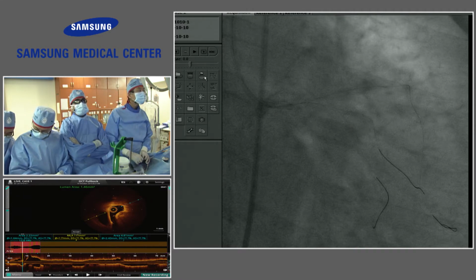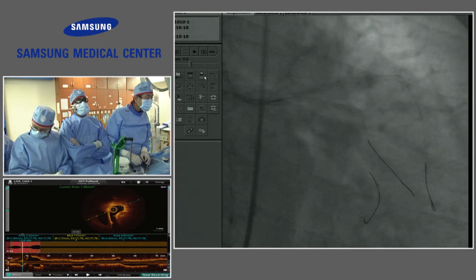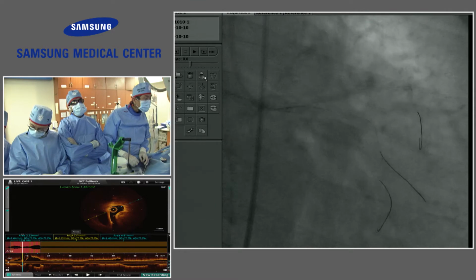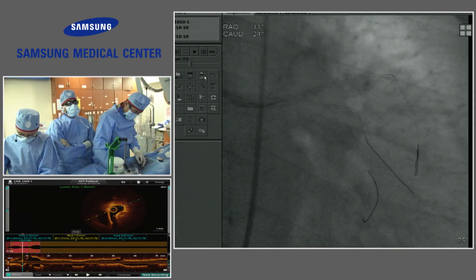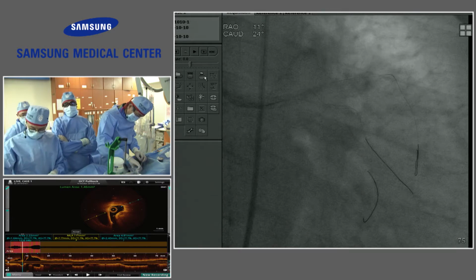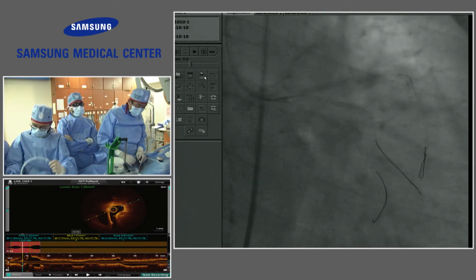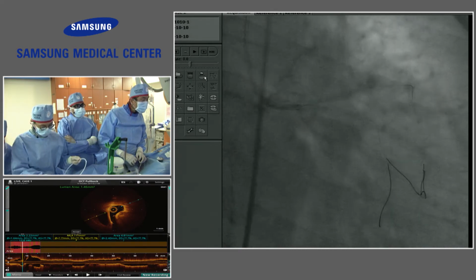Where we would have more trouble is if the left main is very large, 5.5 or larger. In those situations, it can be difficult. Francisco Prazeres published that 1 in 5 frames of the left main may be inadequate for total visualization, but 80% of the artery can be visualized with OCT.